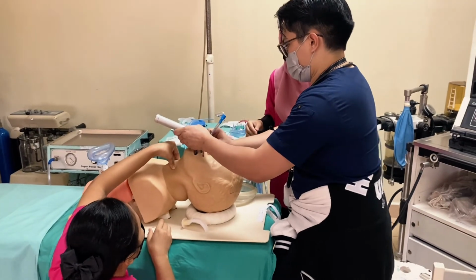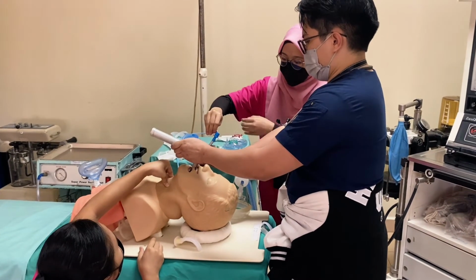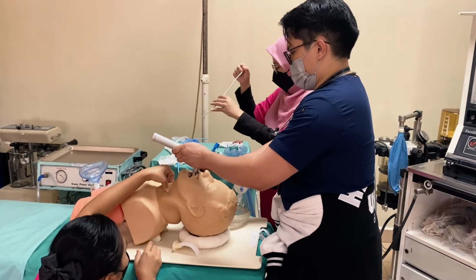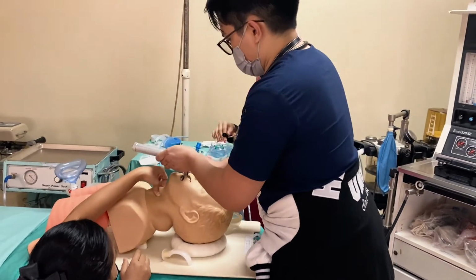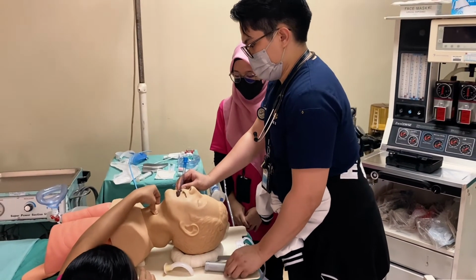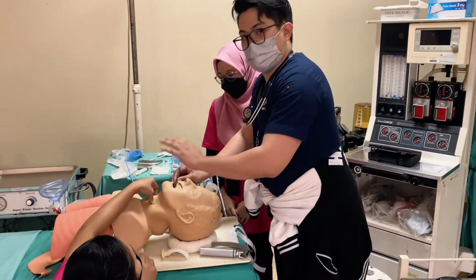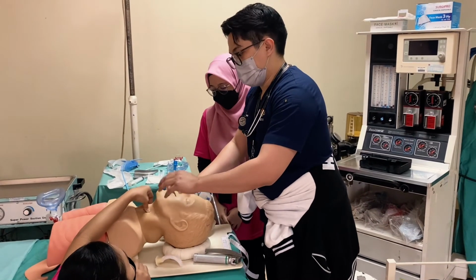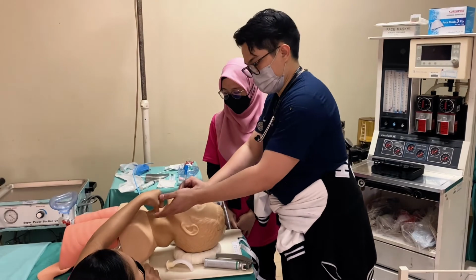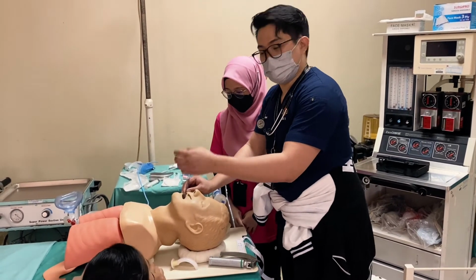Okay, then after that we ask our assistant to pull out the stylet, and we'll push the tube inside. Then after the placement, we'll pull out our blade and make sure. Then after that, during our assistant giving cricoid pressure, it's important that as a leader, we will say, okay, cricoid release. Release the cricoid to the patient.